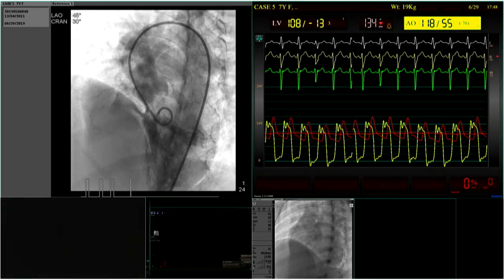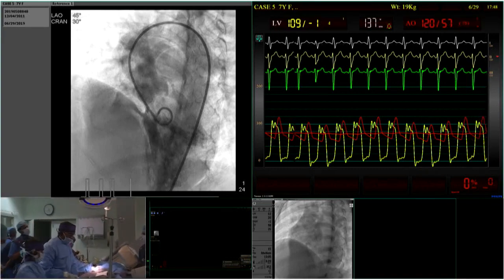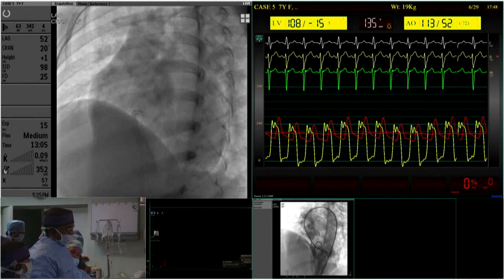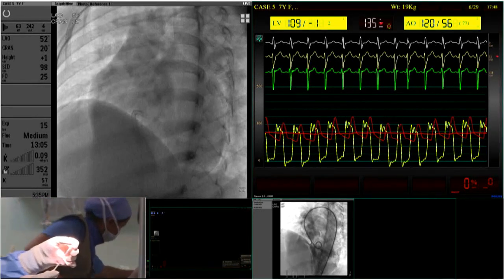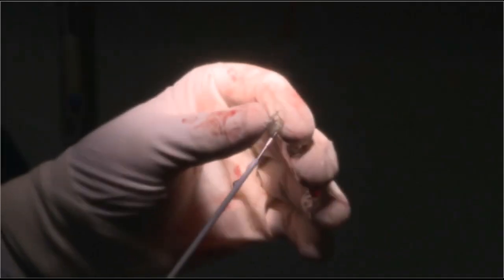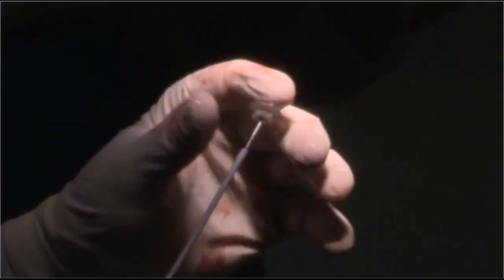Joe, the advantage of this particular device is that there is no tension on the cable after the cable delivers the device in its requisite position, because it is a tilt mechanism. Can you see that now? Can you make it larger? Like further. Okay, focus. You see now, there is a complete tilt of the device. So whatever be the alignment of the ventricular septum, it will adapt to that orientation without any tension on the cable.